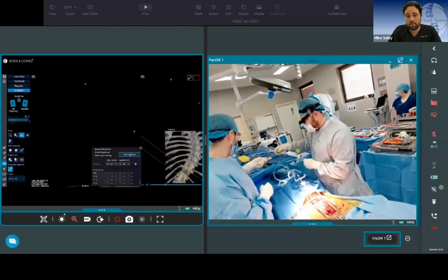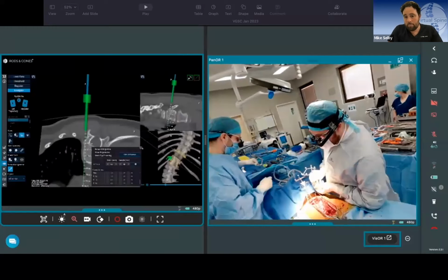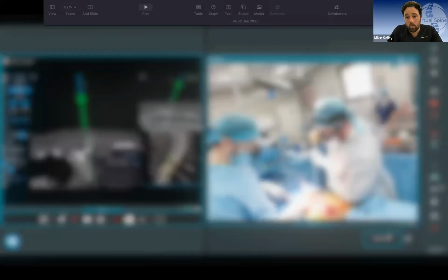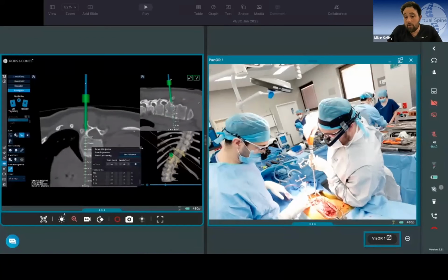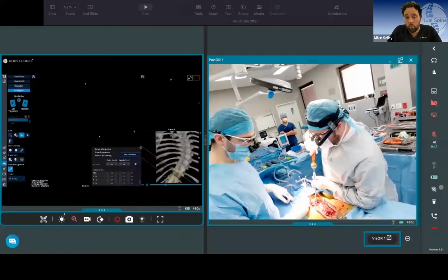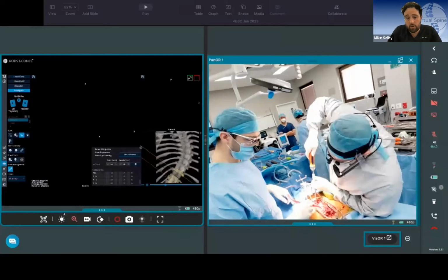So just pretty routine. And so, just hide that for a moment. You've got the pedicle feeler you can use, the navigated pedicle feeler. So you've really got all the little tricks there, and then just navigating the screw in. You can choose to navigate the screws, or if you're happy to put them in over a wire, you can do that as well, and that can speed up your workflow a bit. So you've got multiple tools that you can use, like most nav systems, really.